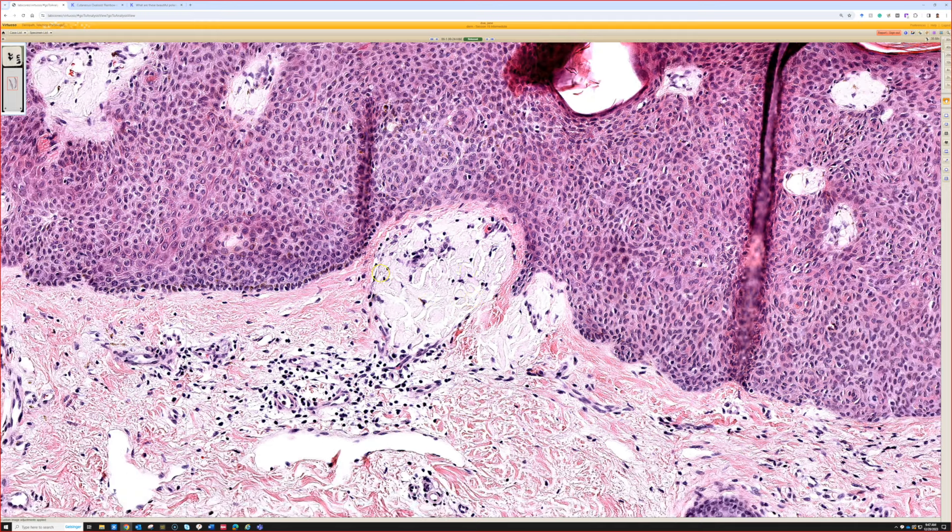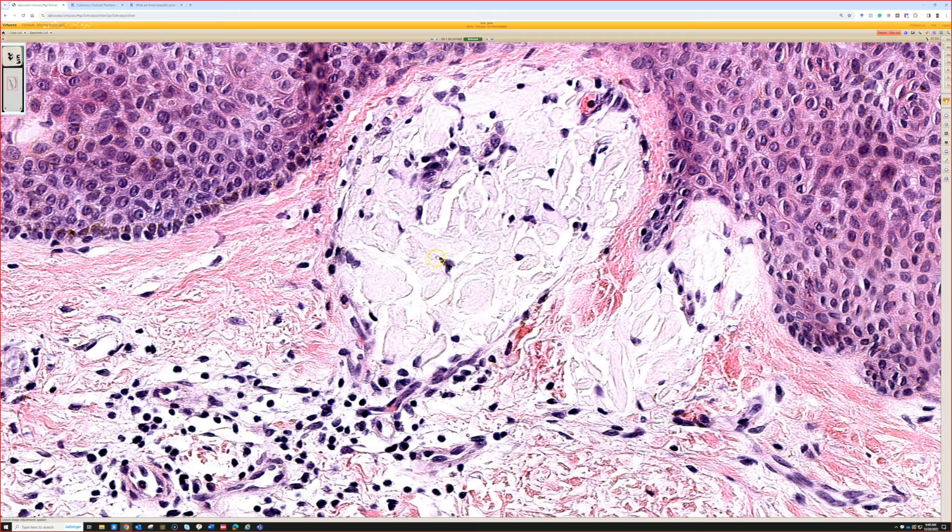This is the same kind of amyloid — it's keratin-derived amyloid. It has pink aggregates and cracks, and in the cracks there are little melanophages with bits of melanin pigment that have dropped out of the basal keratinocytes, along with keratin and other proteins, and aggregated here in the superficial dermis directly adjacent to the seborrheic keratosis. It's produced keratin amyloid, which is a relatively common incidental finding.